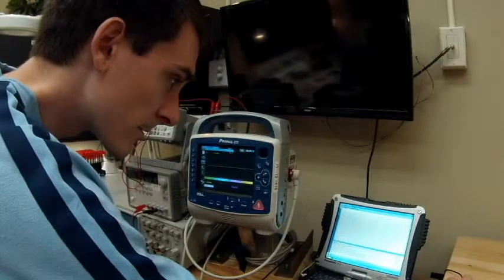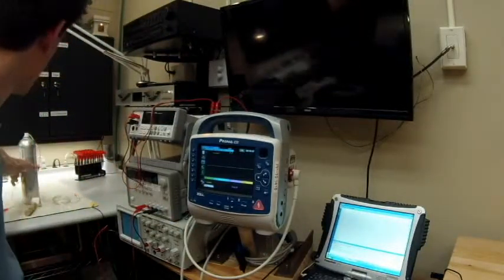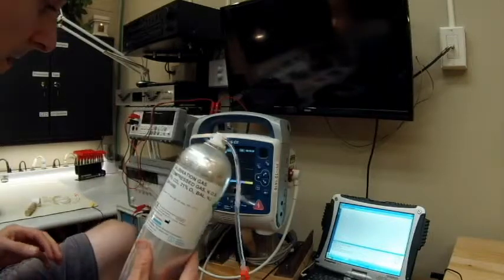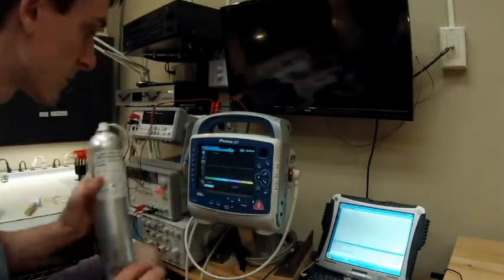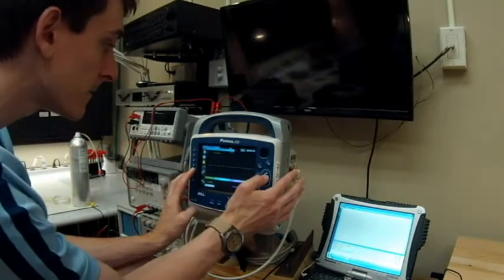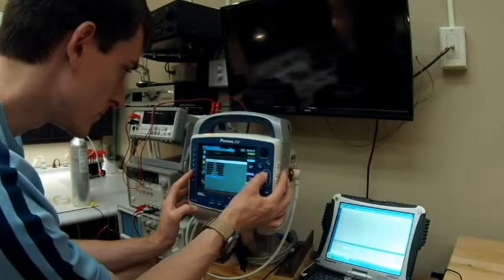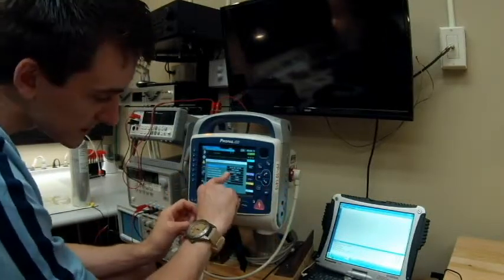The next test is end-tidal CO2. For this, we need a five percent CO2 calibration gas — that's what is required for this unit. To access calibration, we go to the back button, then the gear/supervisor menu, enter the passcode, go to service, then diagnostic. That's where we see the CO2 section — it shows the last calibration was done on the 26th, which is two days from now.